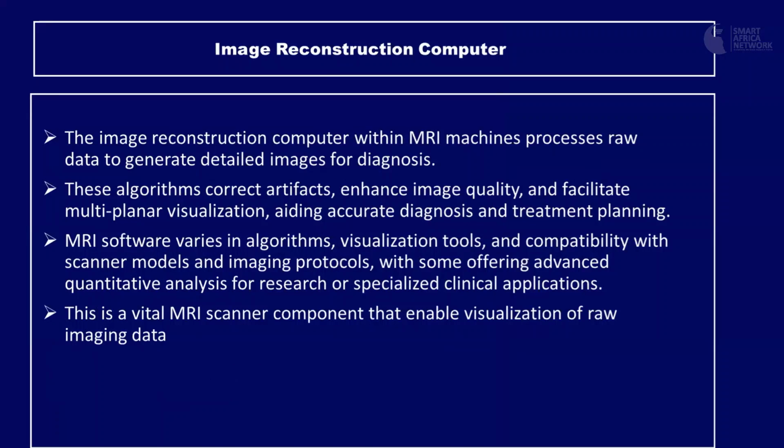Then the image reconstruction computer. We have different algorithms, software, different MR software that varies in algorithms, visualization tools. It all depends on the manufacturer. This can come in different configurations.